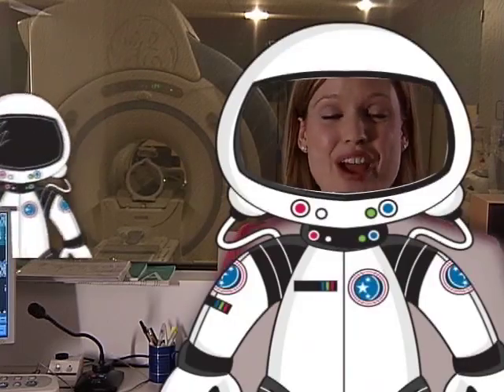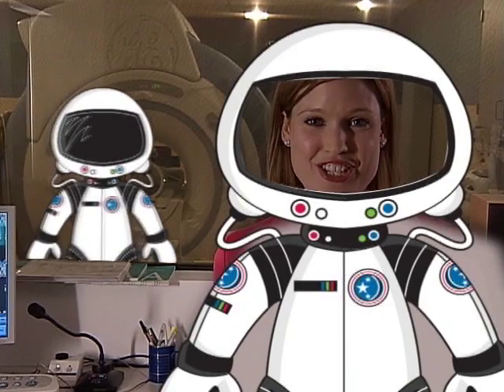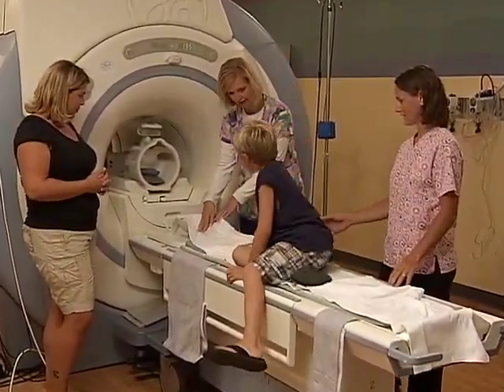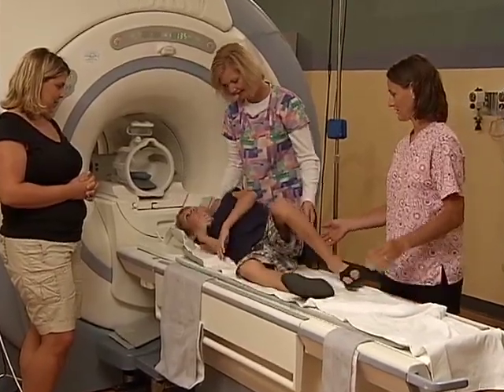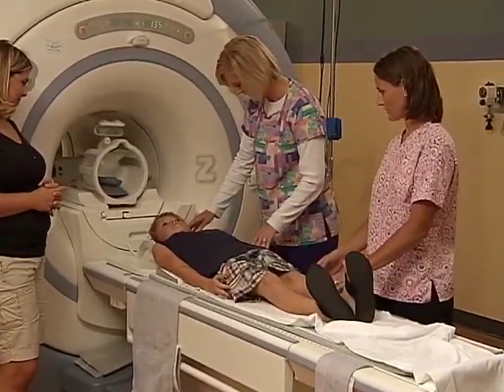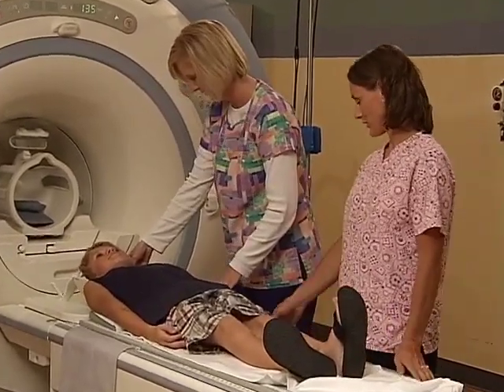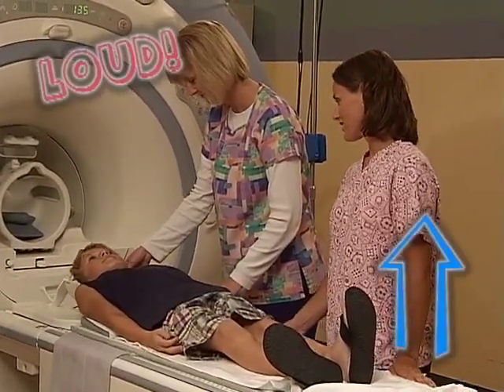She can even talk to you while you're getting your picture taken. Just like an astronaut, you'll need to get strapped in and suited up for your journey. When you're ready, your nurse will help you lie down on the bed and put your head on a special pillow, just like you would if you were taking a nap. But this bed can move up and down and make some noise when it does.